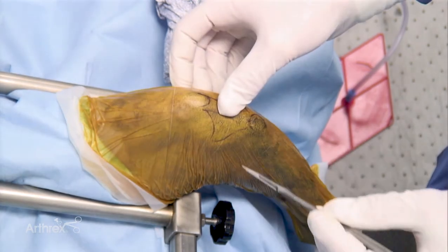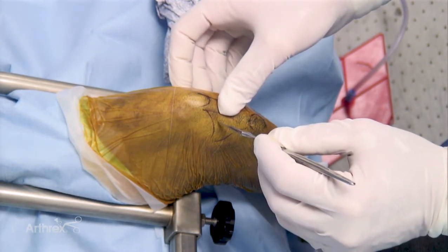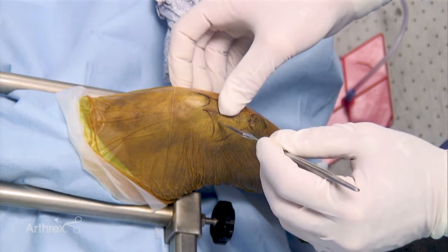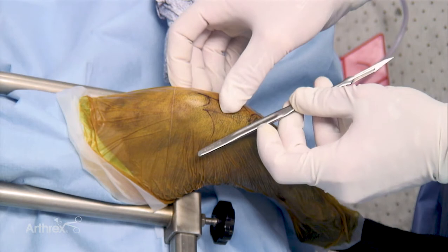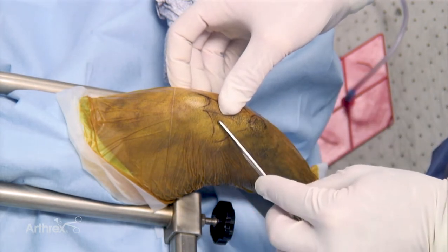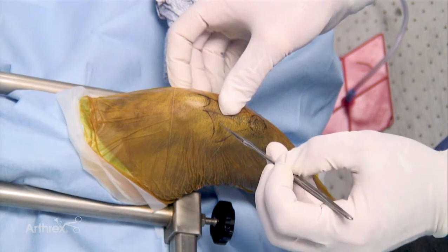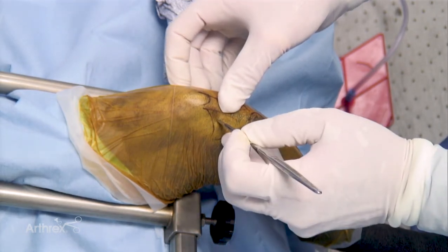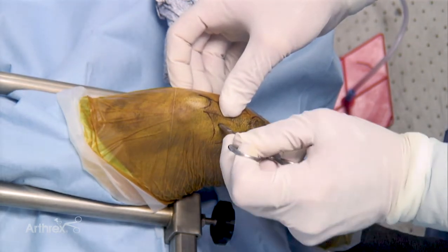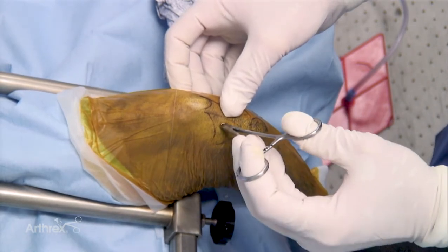Once the joint is distended, the first arthroscopic port is created. This will be primarily an instrument port in most cases. It is crucial to determine the position of that port. If one looks at the medial joint line and the condylar arc, placing that port two-thirds of that distance from distal to proximal is recommended. The 11 blade is inserted carefully until the joint is breached. A straight hemostat is then placed into that port to allow distention and opening of the joint capsule.